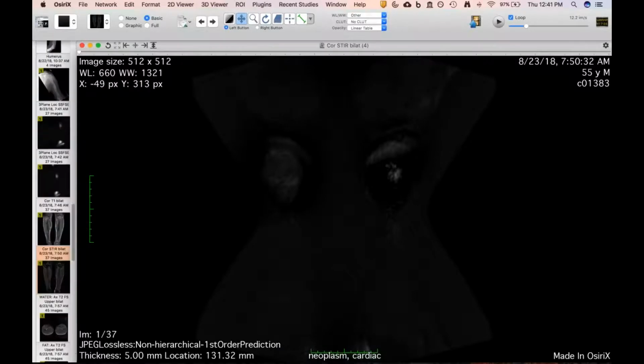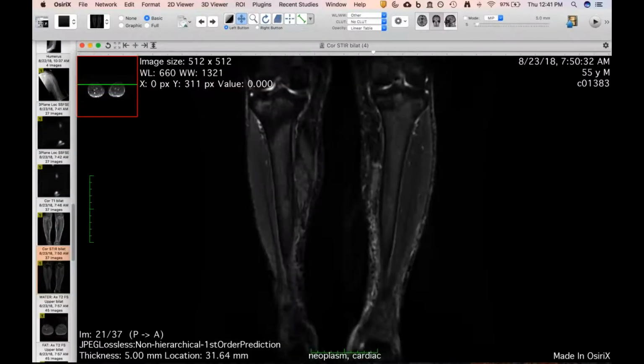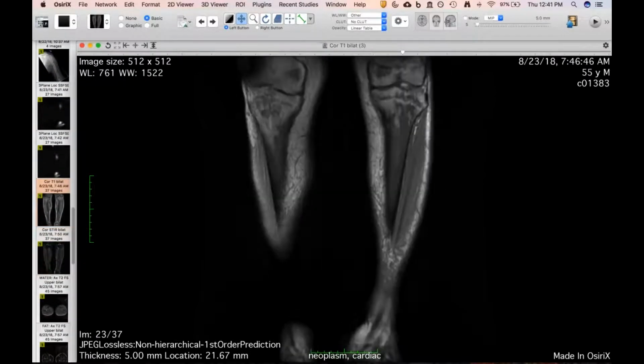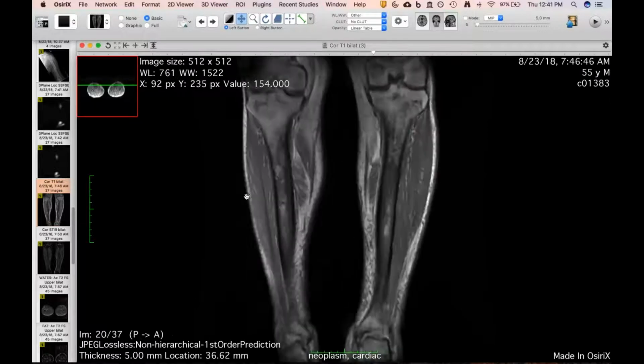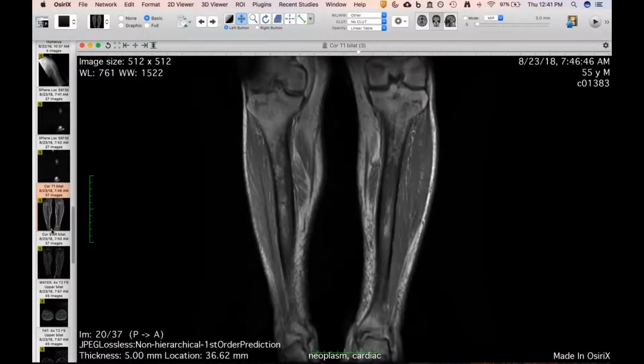And they subsequently did an MR this morning, and you can see, let me get these T1, you can see that there's infiltration of the normal marrow fat with the lower signal intensity stuff. So that all goes towards Erdheim-Chester as the diagnosis here.